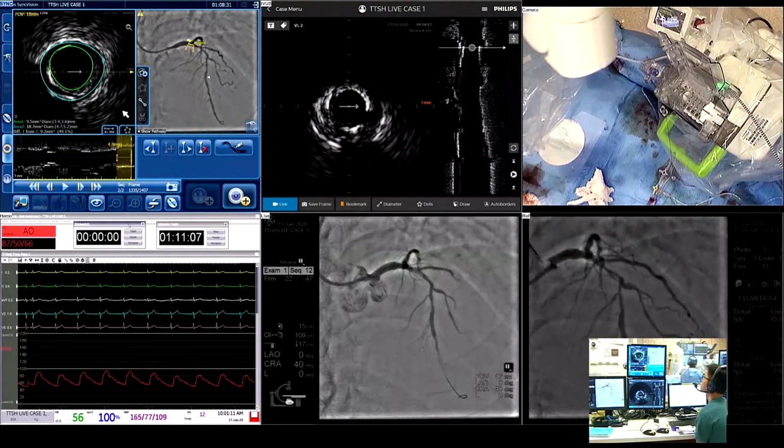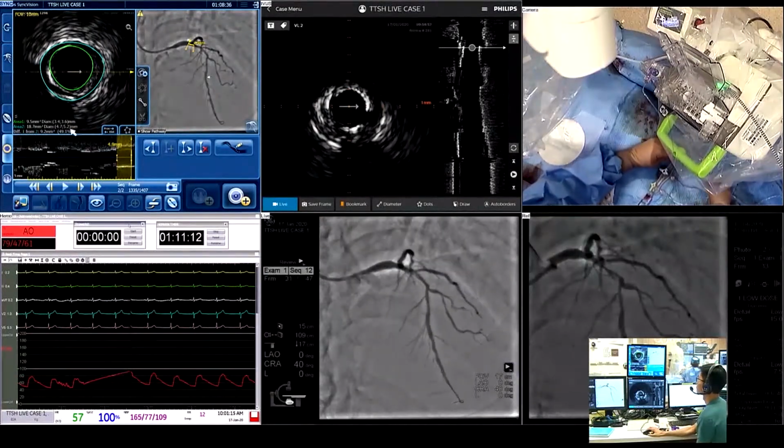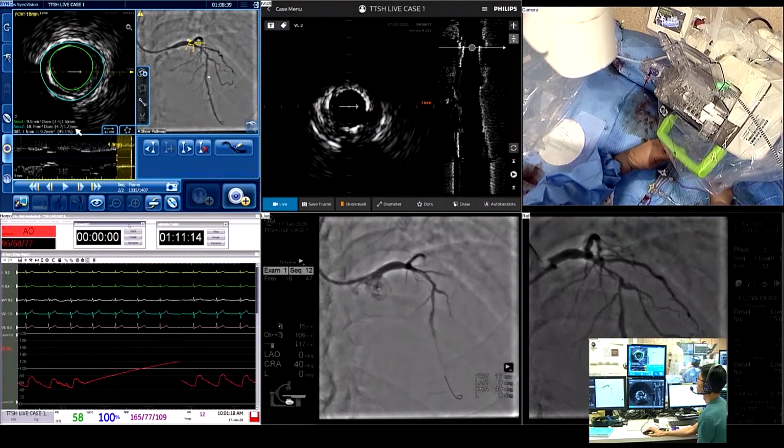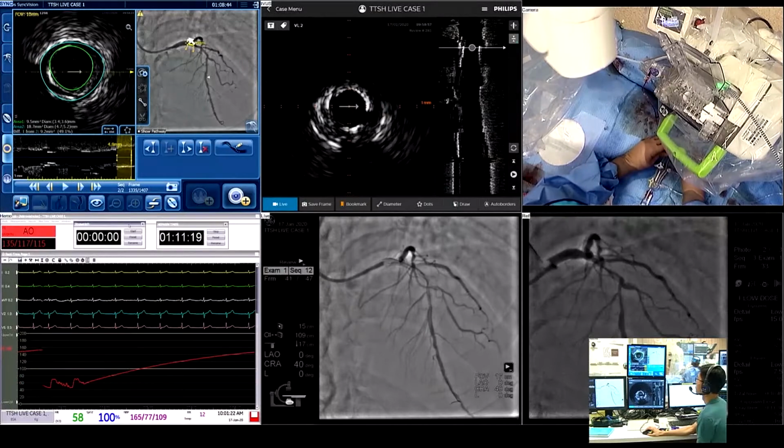So I spare Deborah the agony of doing it inside. Okay, so this is 3.4, 3.5, 3.6, okay? So now can we go from there to distal and see how long I need? So this answers your question.